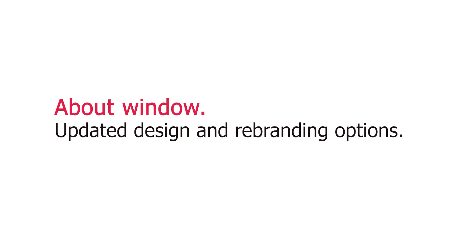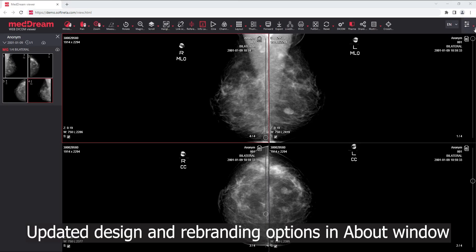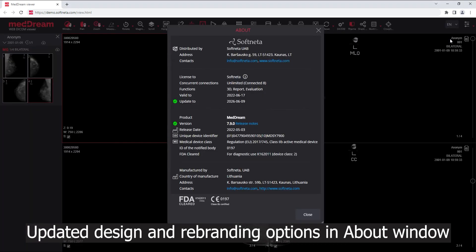About Window: updated design and rebranding options. Updated design and rebranding options are now available in the About Window.